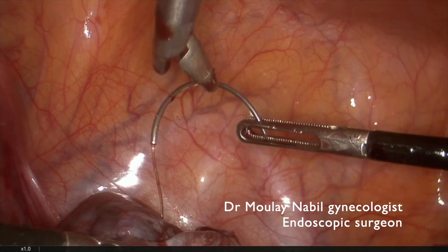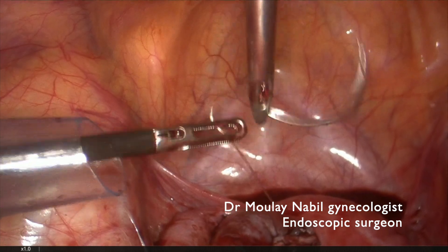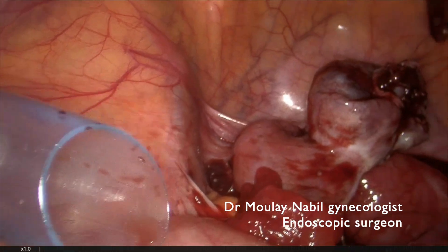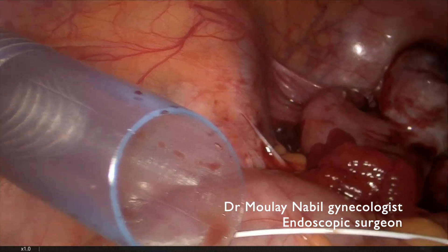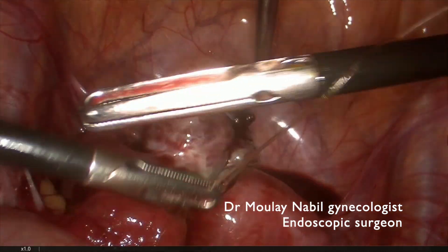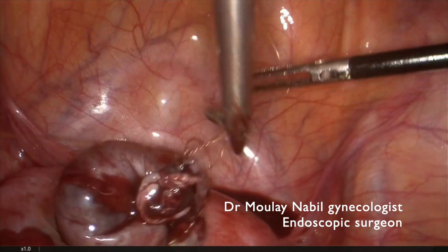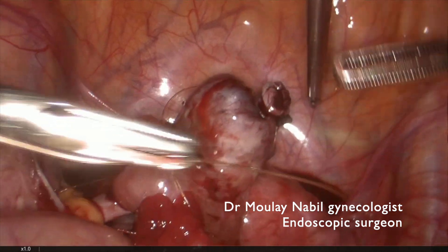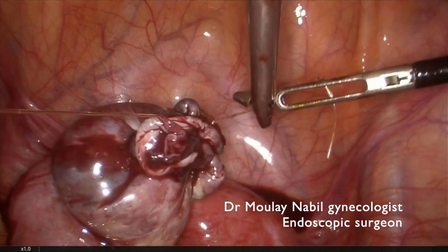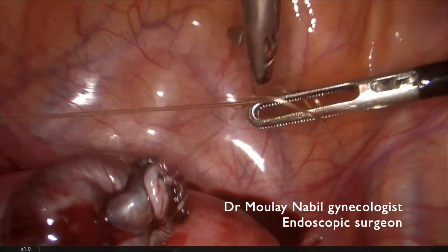You can see the recoloration of the adnexa. As you see, we just place the knot without over-tying. It is important to do these stitches because this maneuver allows you to avoid using any energy source that can decrease the ovarian reserve. We just knot without tying too tightly.